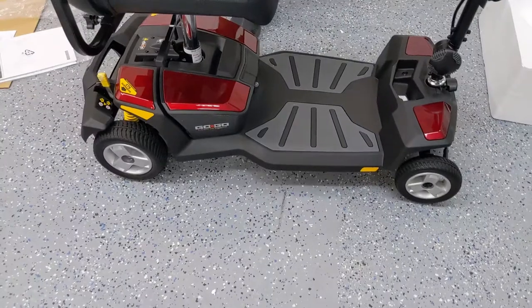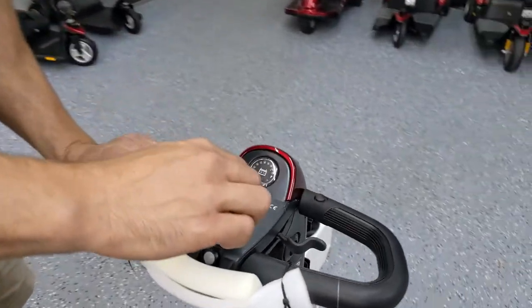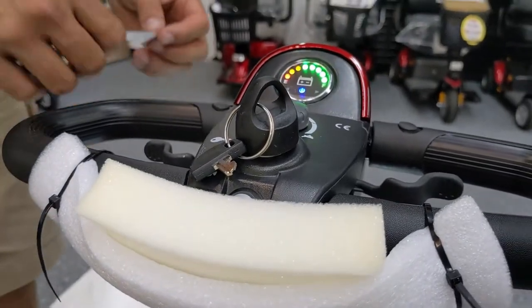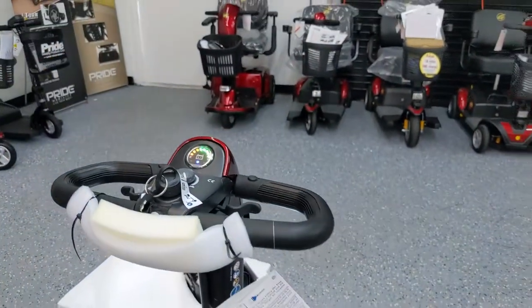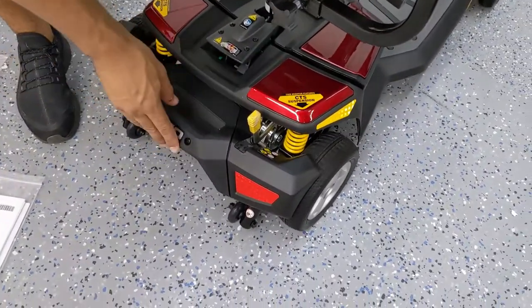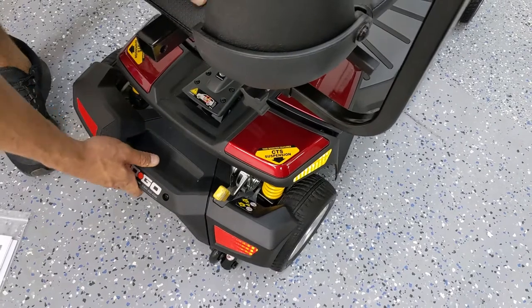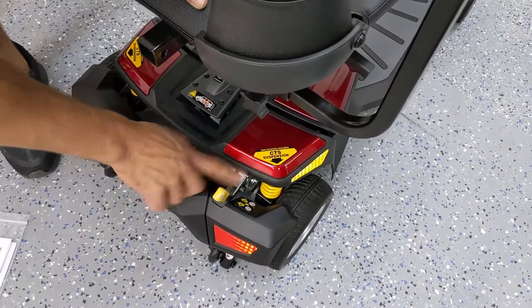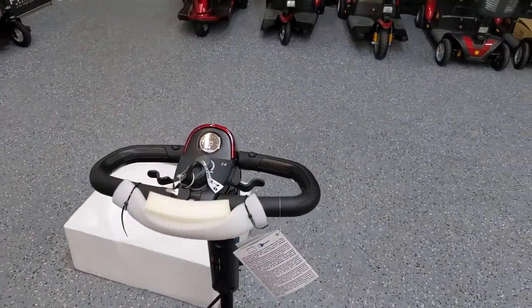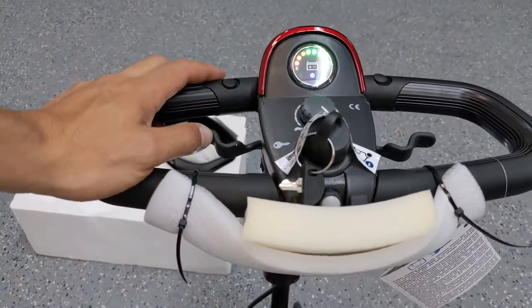Once the battery's in, you can go ahead and take the key, put it in the ignition — there's only one way to go in. Turn it to the right. If you hear a beep code, that's indicating that the unit is in freewheel mode because we pushed it out of the box and never put it back into drive mode. You have to put it in drive mode for the scooter to work. Now that the brakes are engaged, we're not getting a beep code and the unit works.